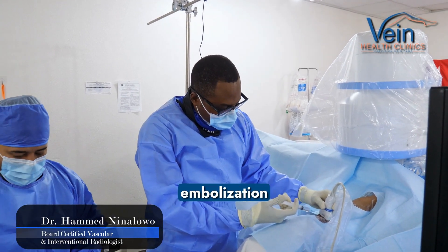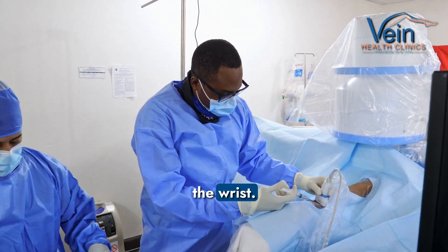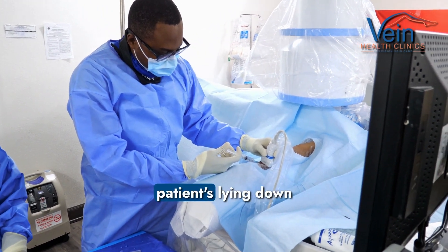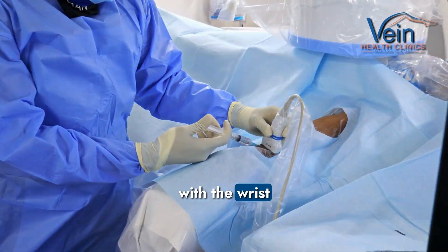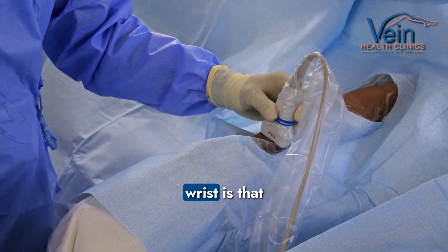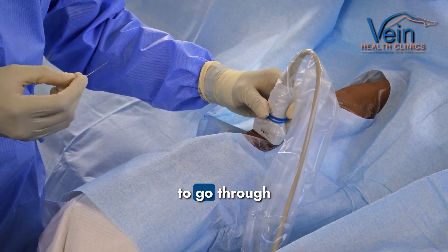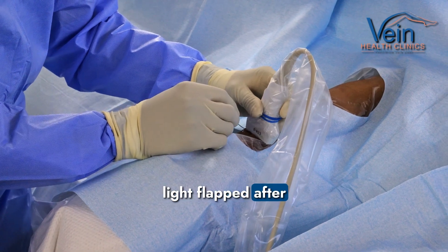We're starting a uterine fibroid embolization procedure through the wrist. This is something called radial access. As you can see, the patient's lying down very comfortably with the wrist outstretched. The advantage of going through the wrist is that patients could be much more comfortable. We don't really have to go through the groin. They don't have to lie flat after the procedure.